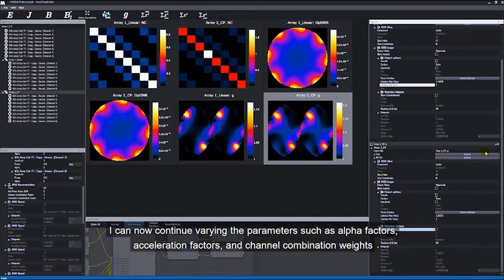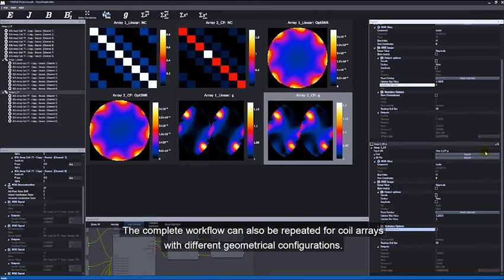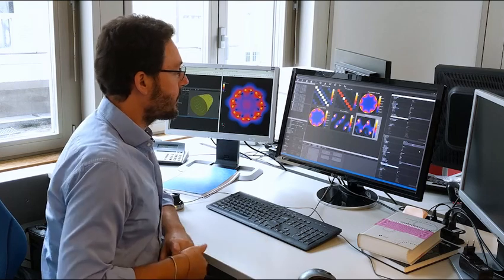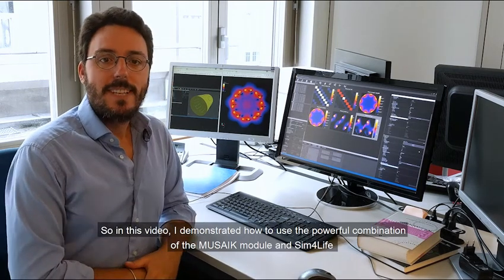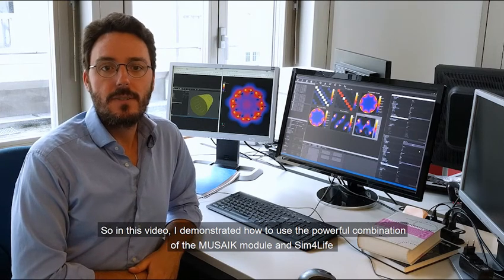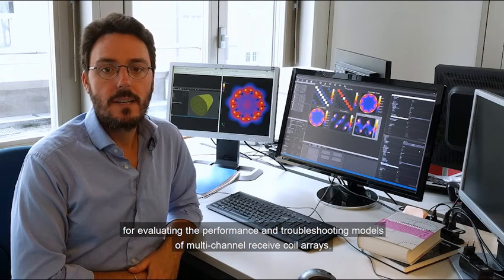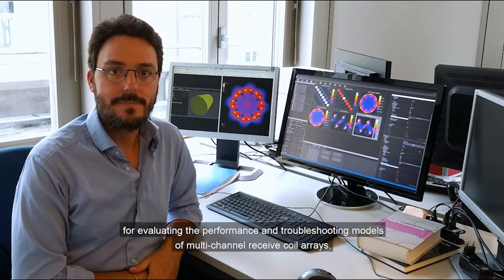I can now continue varying the parameters such as alpha factors, acceleration factors, and channel combination weights until I obtain an optimized setup for a specific imaging field of view. The complete workflow can also be repeated for coil arrays with different geometrical configurations. So, in this video, I demonstrated how to use the powerful combination of the Musaik module and Sim4Life for evaluating the performance and troubleshooting models of multi-channel receive coil arrays.